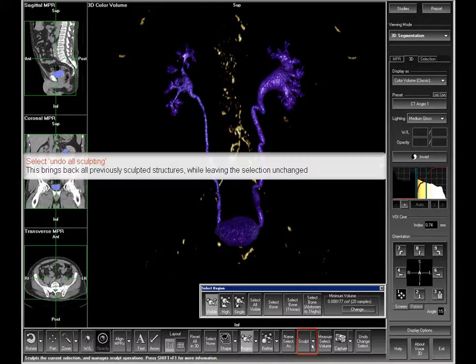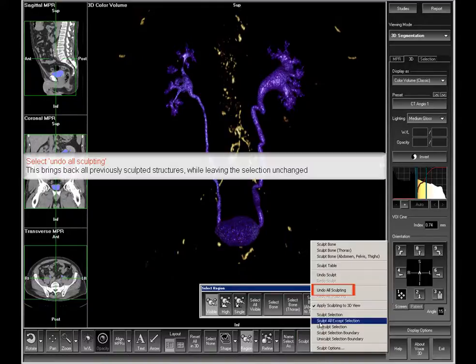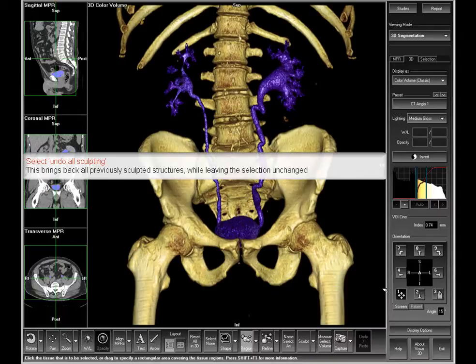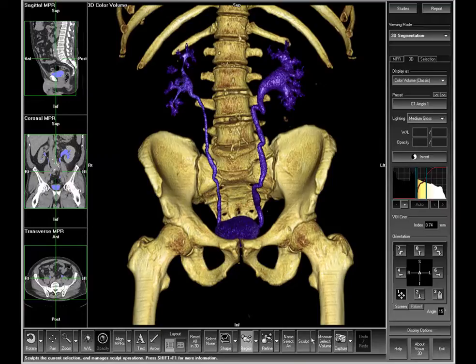From the sculpt menu, select the undo all sculpting option. This will bring back the bony structures while leaving the kidneys, ureters, and bladder selected.